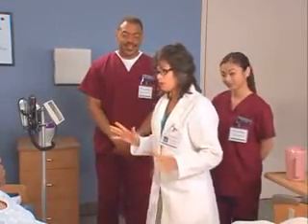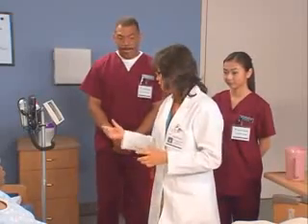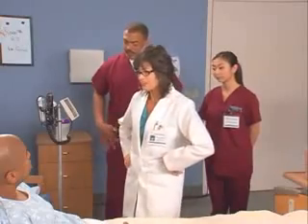So what we're going to be doing is taking your blood pressure and using an ultrasound. The same thing they used when my wife was pregnant. Exactly. We'll get you in position, put some gel on your arm, and listen to the blood flowing through your arm. Any questions? Yeah. Will that thing be able to tell if my arm's a boy or a girl? Well, now that just lost you some points.